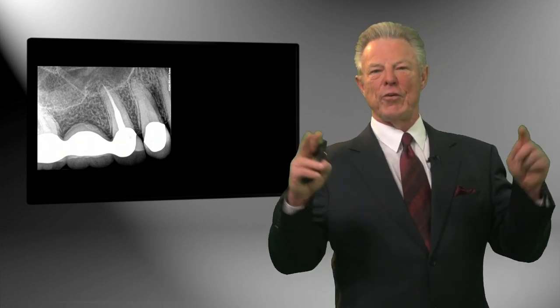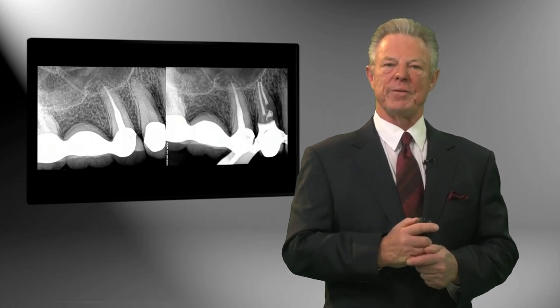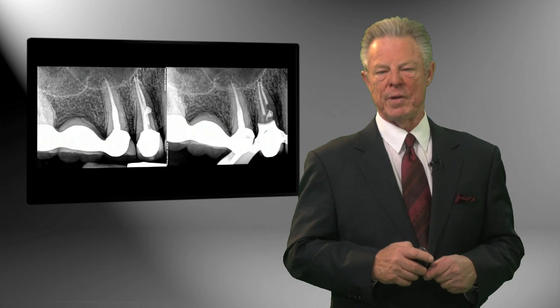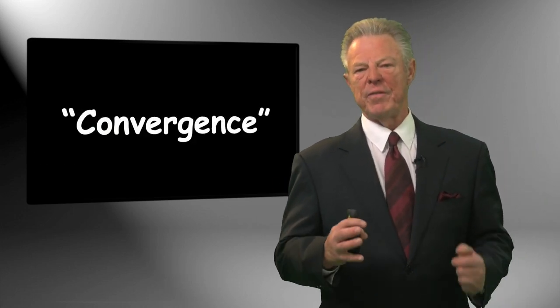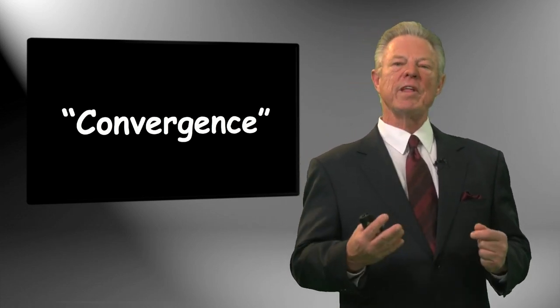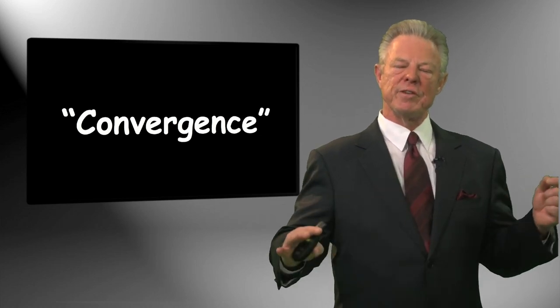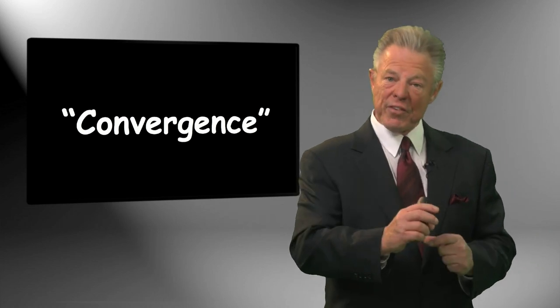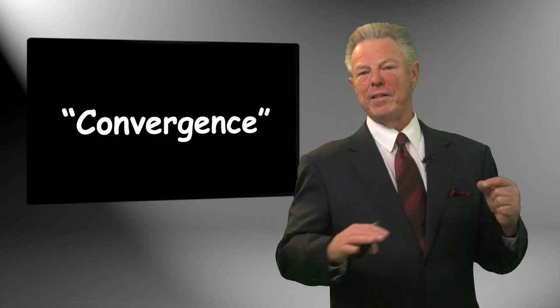Last patient I want to show you is not the one that's there. That is the so-called Coke bottle Gates Glidden look from the past, and you can see the difference by using the right rotary shaping. You can have elegant shapes that allow us a good obturation. So all of these images really have been a convergence of this ProTaper Next technology, examples of that technology. And remember what the convergence really is: it's the progressive taper geometries from the original ProTaper concept. It's the offset core, and then finally the addition of the M-wire.